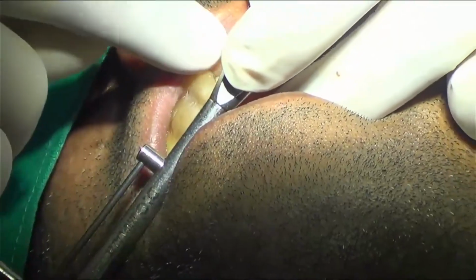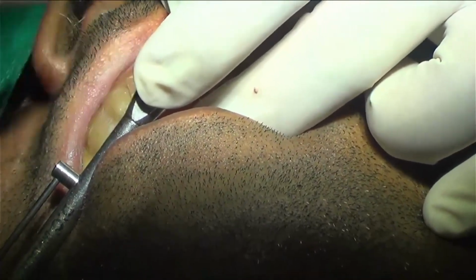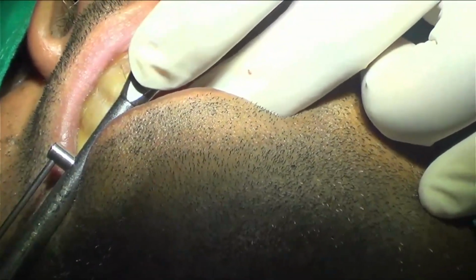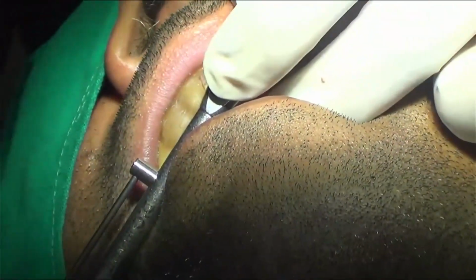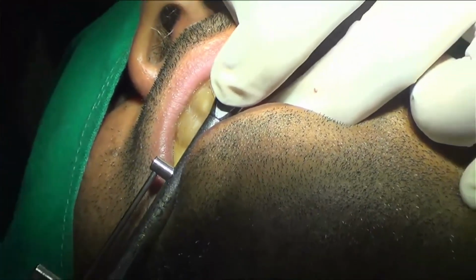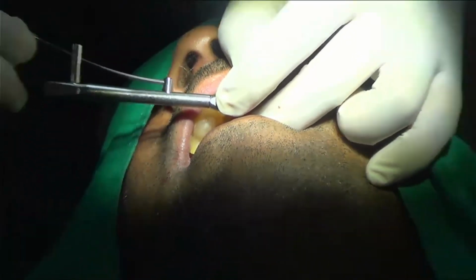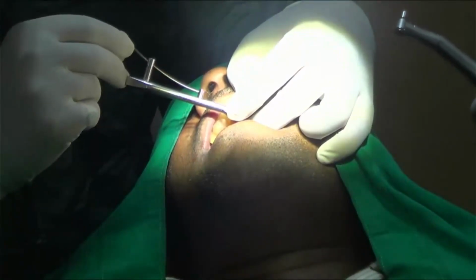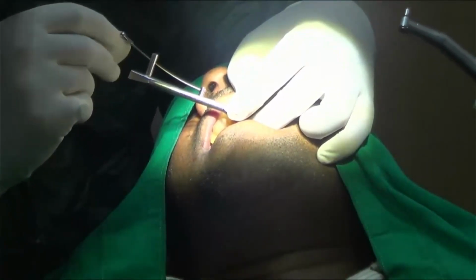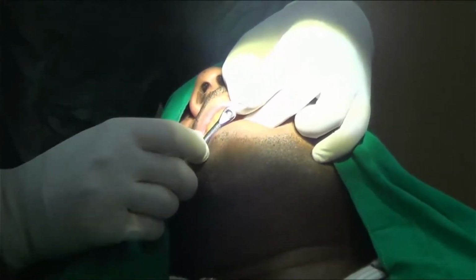In this, my implant connector is going completely flush with the sleeve of the surgical guide. So now my torque is approximately reaching 50. Let us detorque it a little bit.